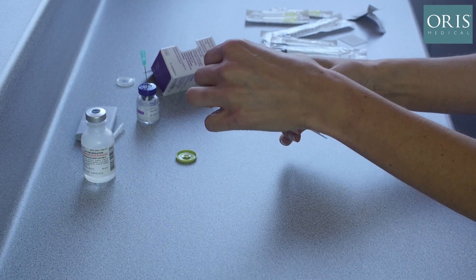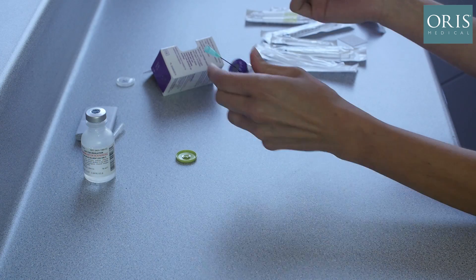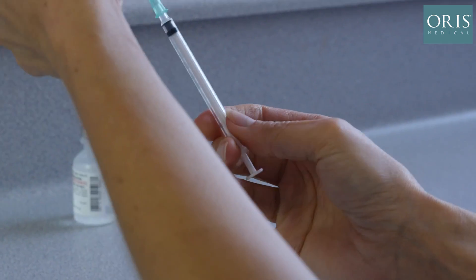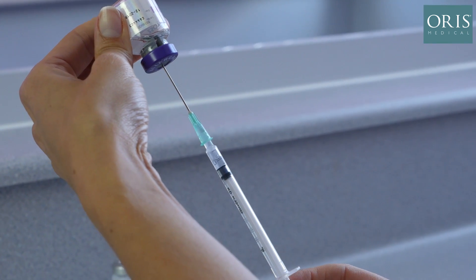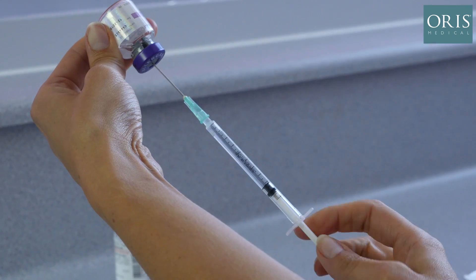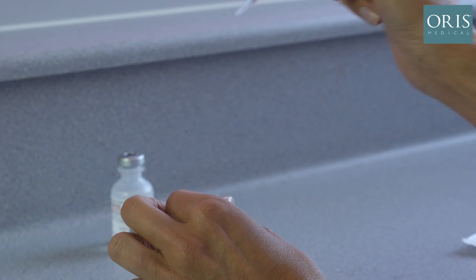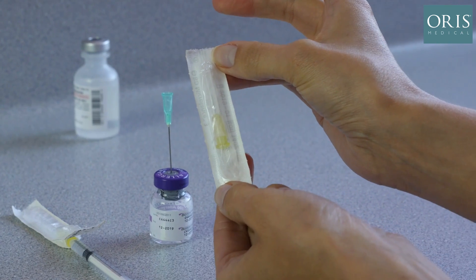We are now ready to draw up our Botox. A 1 ml syringe is inserted onto the green needle. The vial of Botox is placed upside down and we slowly draw up our toxin. Any air must be flicked to the surface and expelled at this stage. We can now attach the syringe to a yellow 30 gauge needle.